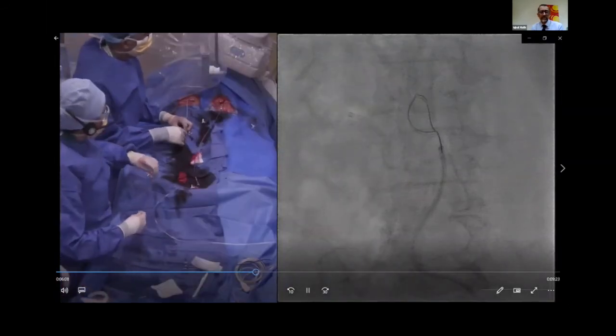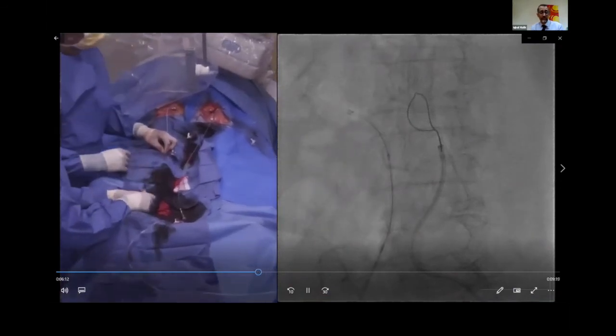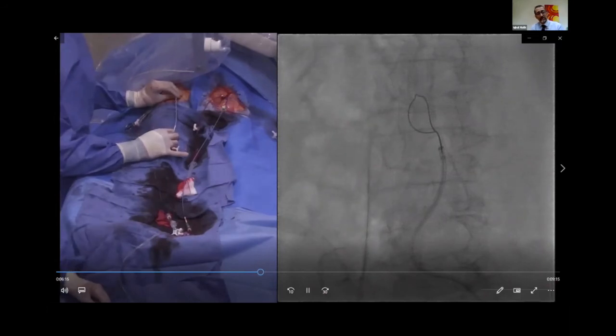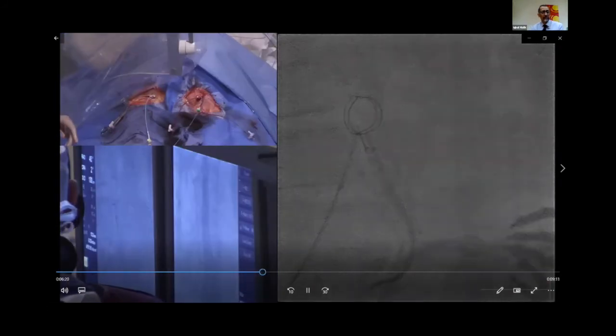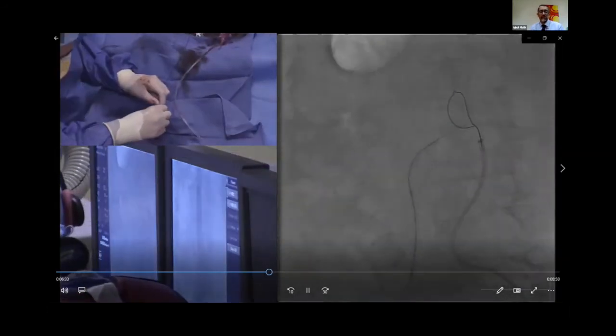And so as you're pushing through, the idea is not to advance the wire too far, because you can, of course, take this wire if you keep on buzzing to the other side of the aorta as well. So we're going to position it and advance the wire so it just gets into the aorta. So you can do 2 views. A biplane lab is handy. So you've got in the middle of the bullseye, and then you're going to just advance the wire while you press the diathermy for just a moment.